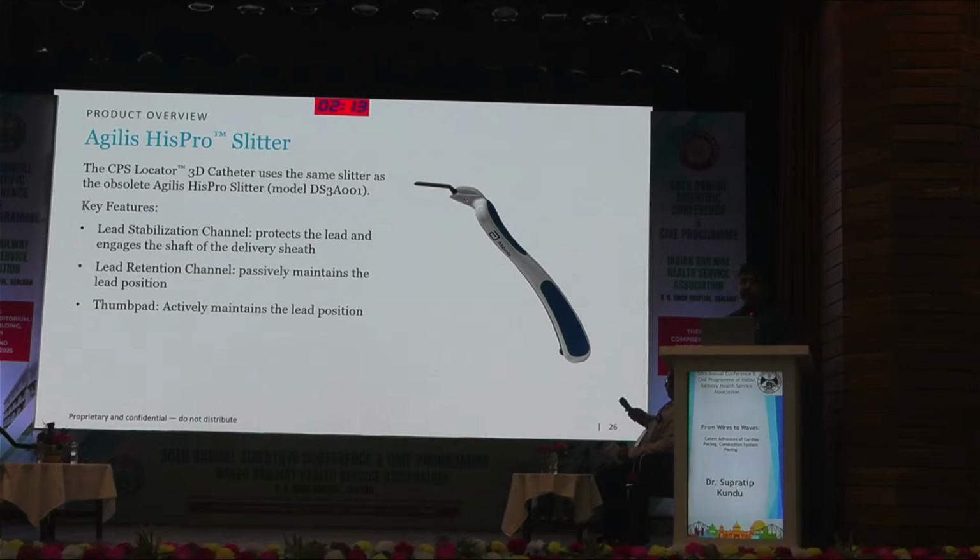And the slitter is one good one, and this is the Abbott Agilis HisPro slitter.